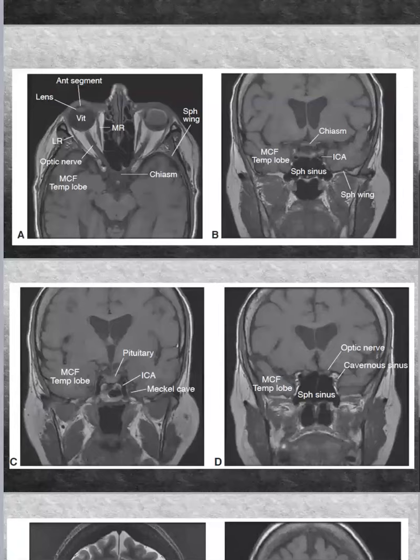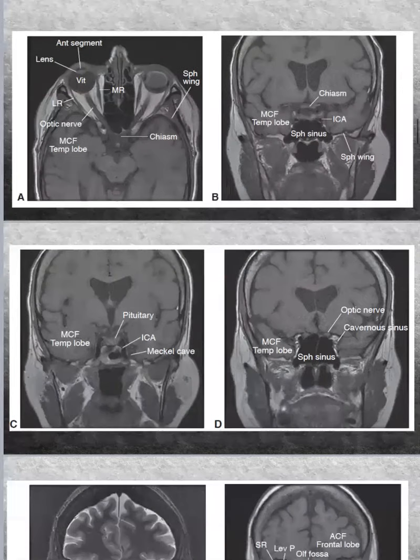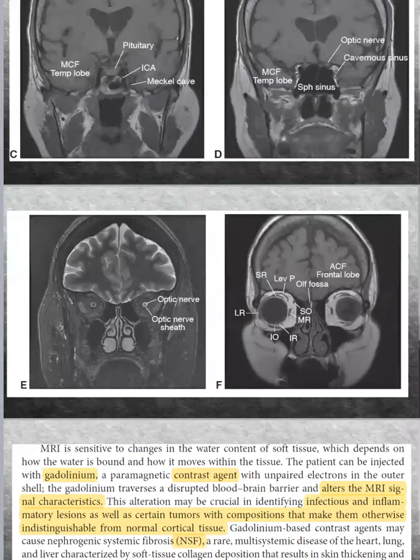Okay, so if I have some person like that, and this person, if we have a cut here and a cut here and a cut here and a cut here, all of these cuts are anteroposterior cuts and will give me variable appearances. By the way, the appearances are beyond the scope of this course and beyond the scope of ophthalmology, and they may require some lectures.